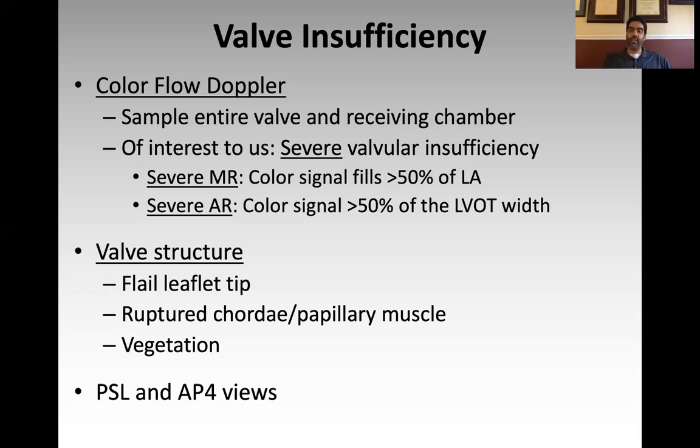Because what you want to judge is, if you're seeing color shooting from the left ventricle into the left atrium, and that color jet is filling more than 50% of the left atrium, then that is a clue that you may be dealing with severe valve insufficiency.